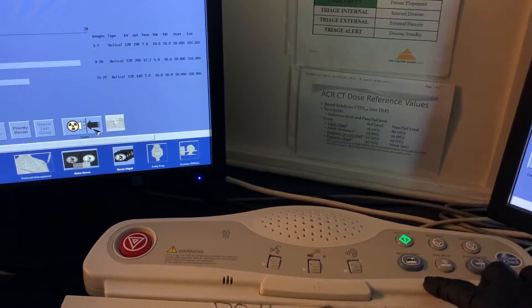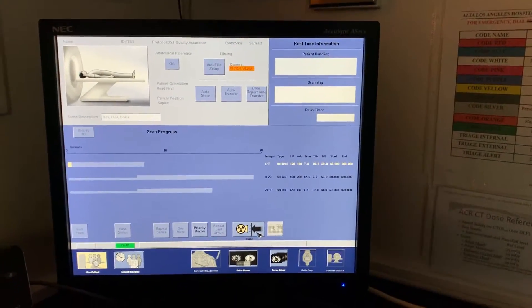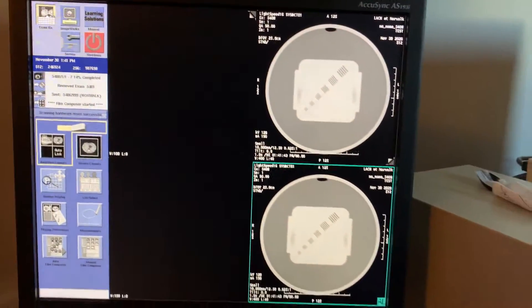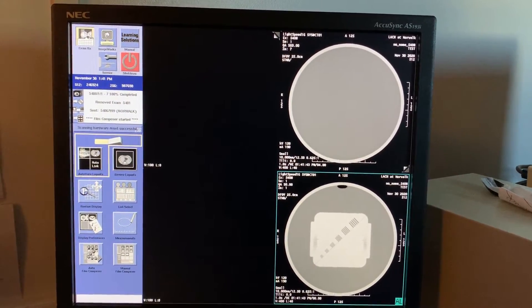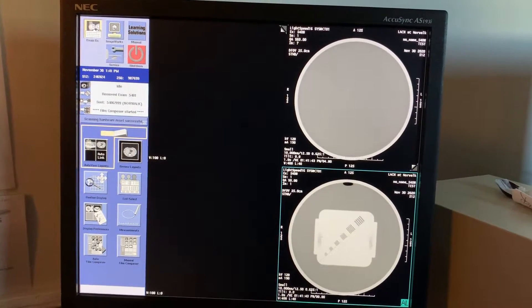Give the rotor some time to spin up, then click the Start button. If you have your screen on the right side set to auto, you should be able to see your current exams here. Quickly review them for artifact or any anomalies.